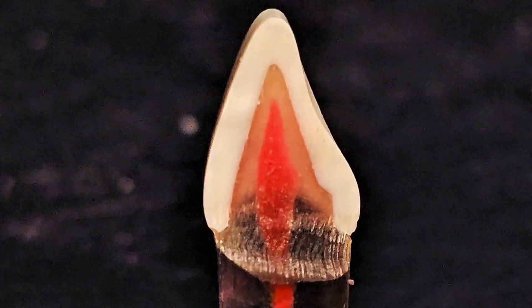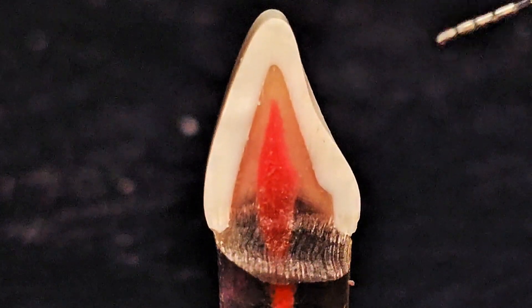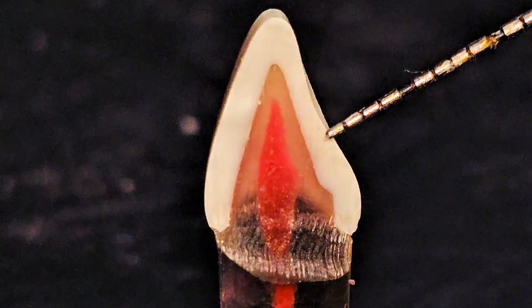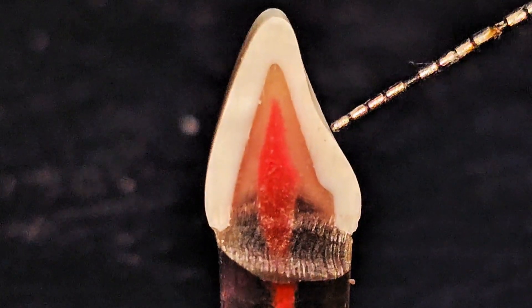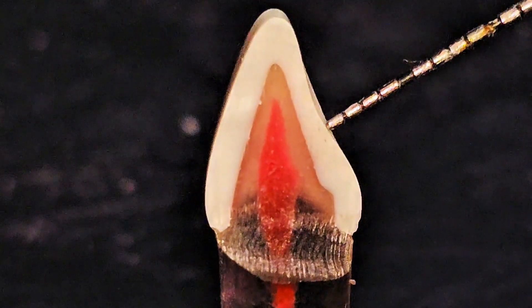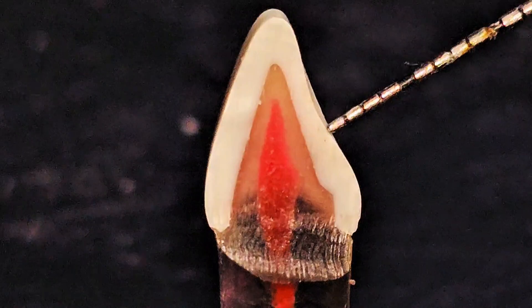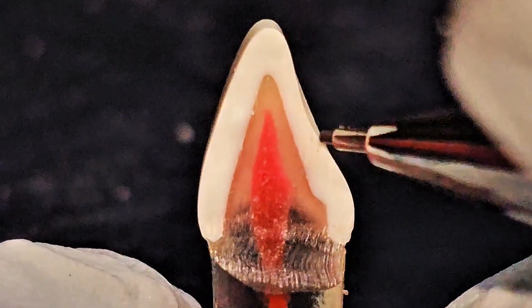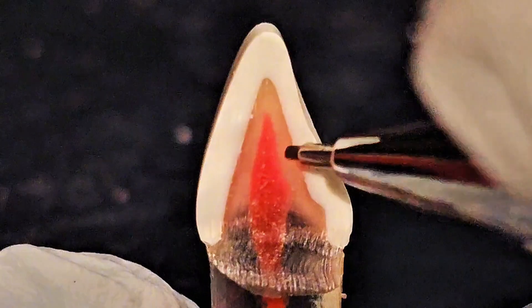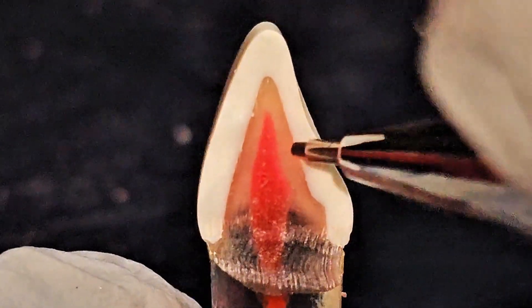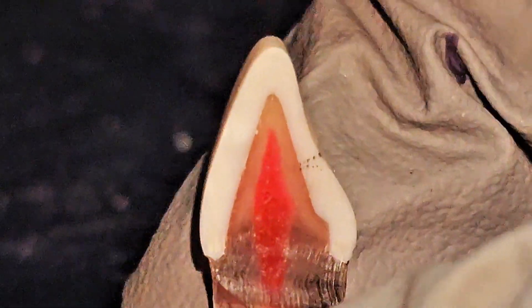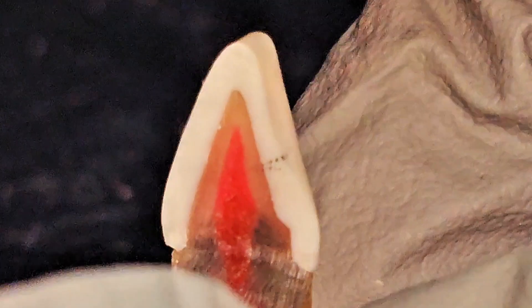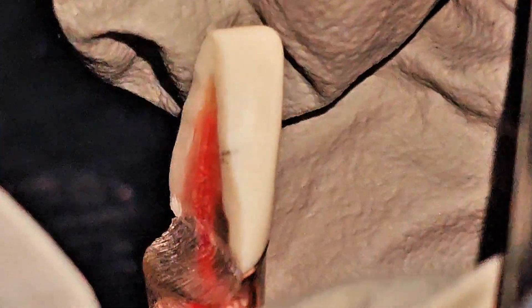Okay, I cut the tooth. And now let's see how much we need to penetrate. This is a good area to penetrate, right? Let's mark it with the pen because I think this is the safest area to penetrate. So if you turn it this way, it is right here.